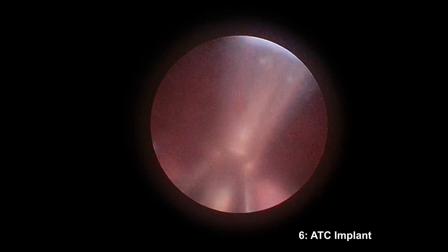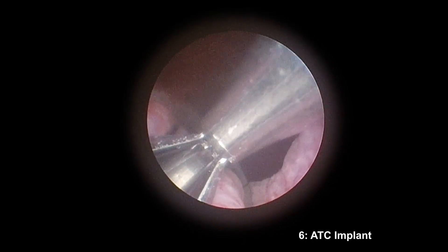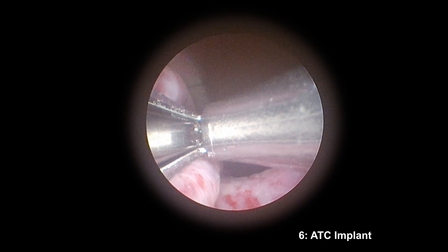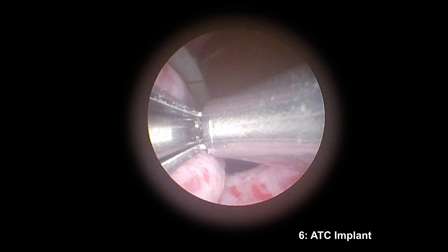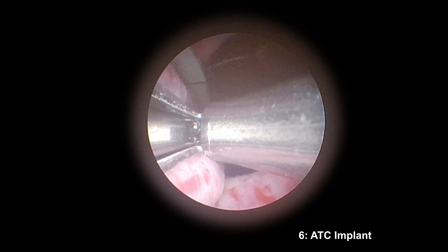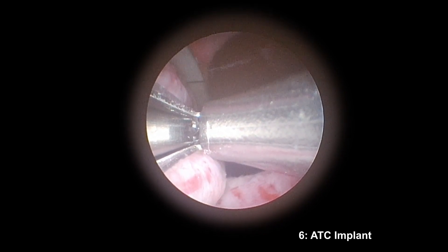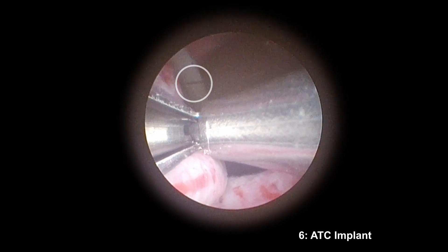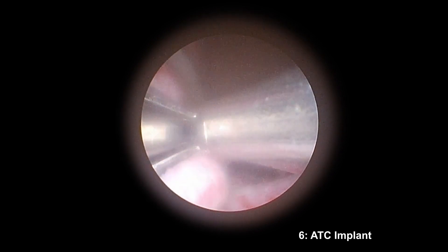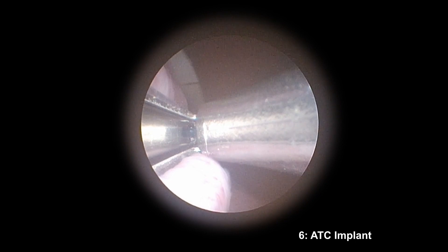After the first OML implant, I reassess the anatomy and feel there is still opportunity for movement of the OML. I decide to use another ATC device. Using the same technique as before, starting with the keyhole and needle location markers at the bladder neck, I re-engage the OML with the flexible stainless steel wings, pull the tissue into the prostatic urethra, and compress posterior laterally. Once the OML is sufficiently compressed, I deploy the needle, which is aligned with the needle location markers on the wings. Again, after needle retraction, I advance very slowly toward the bladder until I see the white line, and then place the urethral end piece and cut the suture, completing the implant.